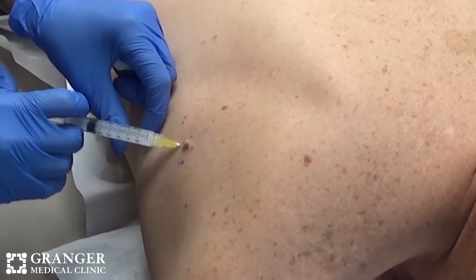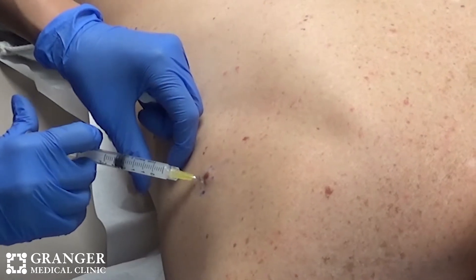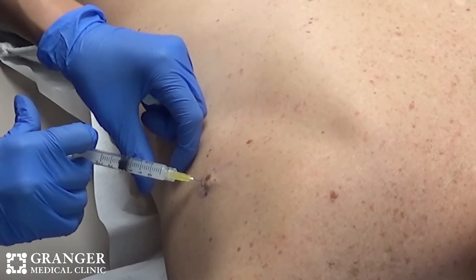When a patient comes in and I determine that a mole or lesion needs to be shaved or punch biopsied, we cleanse the area and get comfortable. We do numb the area with a localized numbing solution — essentially lidocaine with epinephrine. It's pretty quick; it is somewhat painful with a little burning sensation while we numb it up, and then you don't feel anything but a little pressure as we take the lesion off. Afterward we put a bandage on it, and it literally takes about five minutes or less.